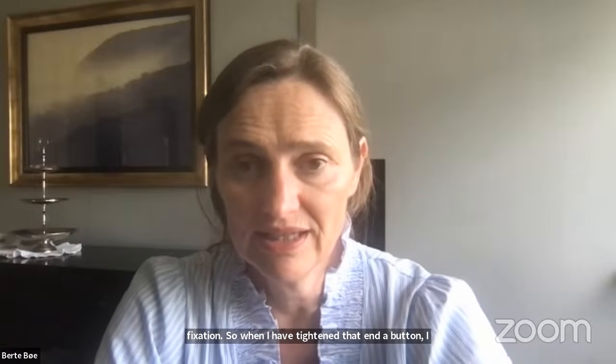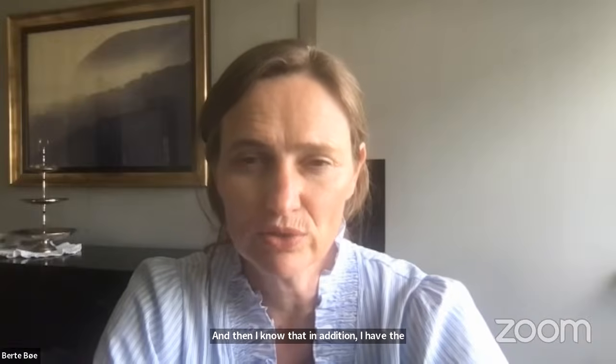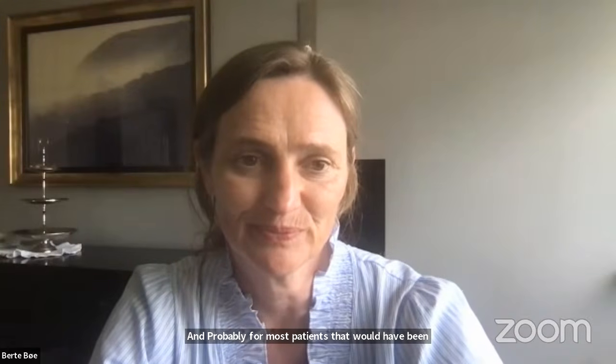And then I know that in addition, I have the anchors around the labrum. So that's also an additional fixation. So the fixation through the bone is in one tunnel. So that's kind of 1-point fixation. And probably for most patients, that would have been sufficient. However, still, I do the fixation of the labrum as well.